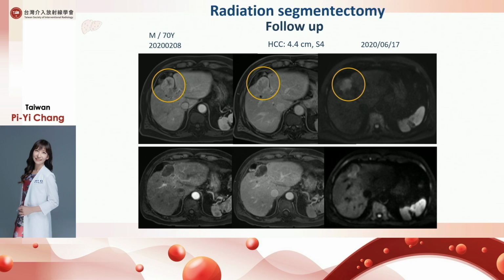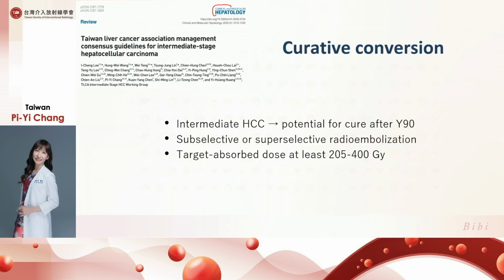You can see the hypervascular tumor. Then after the treatment, you can see the tumor became necrotic well. After the follow-up, it was a complete response case.